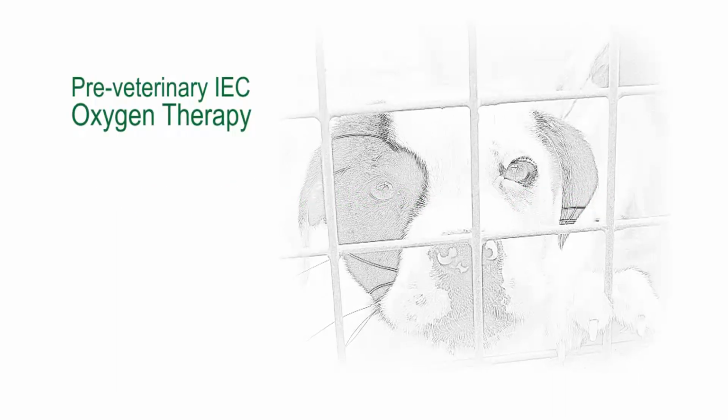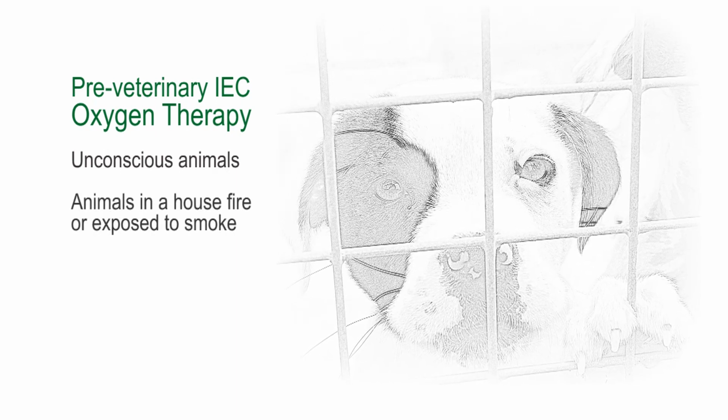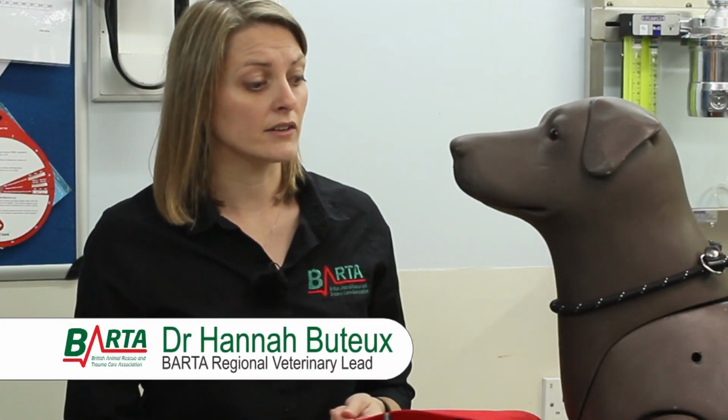So we recommend using this kit for any animal that you find unconscious, any animal that's been in a house fire at all or exposed to any smoke on a scene, and any animal showing any kind of respiratory distress. In animals we would see that as panting or open mouth breathing, heavy breathing, maybe noise on inspiration and struggling to breathe, or the tongue lolling out the mouth. And they can be varying levels of consciousness with that. So any animal showing those signs or have been exposed to smoke inhalation really should be receiving oxygen as soon as possible on scene to improve the outcome for the animal.